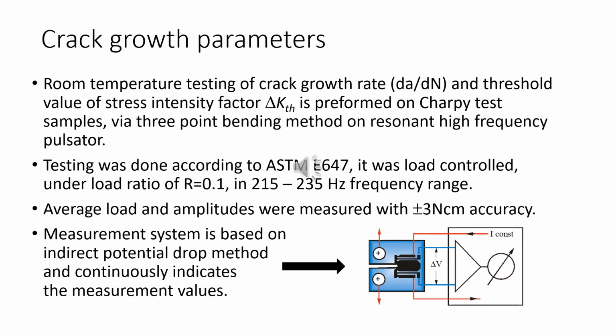in the prescribed recommended frequency range. You can see here also the measurement system, a sketch, which was based on the indirect potential drop method to continuously indicate measurement values. So in this way we can record crack length, and by counting cycles we can get the curve which will provide us with the coefficients of Paris law.